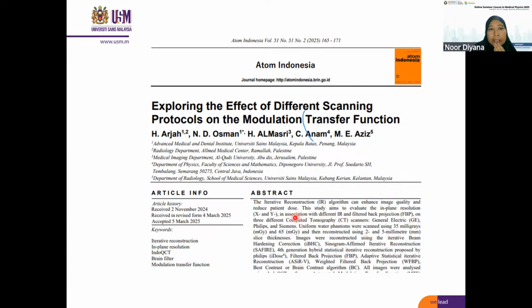Okay, in this study we want to compare 3 different iterative methods, and we want to see the effects of iterative on low dose CT.